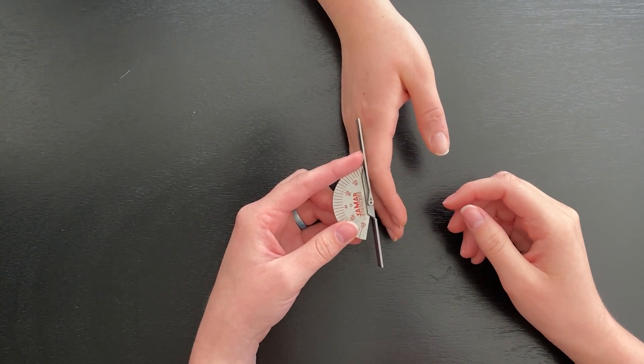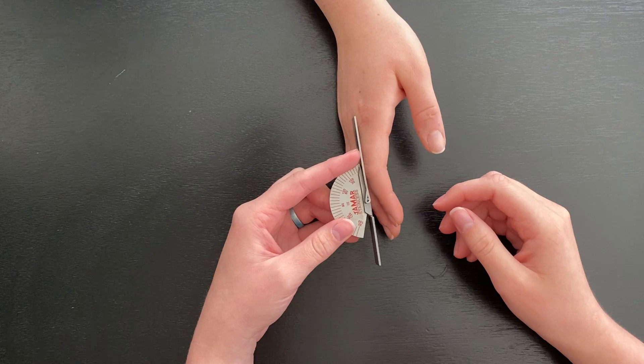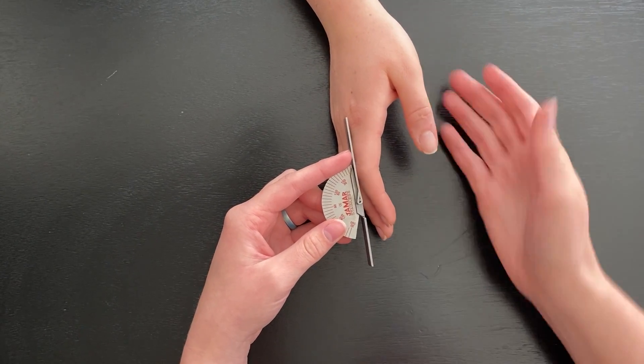You will have the patient seated at a table with their upper extremities on a flat surface with the ulnar side down.